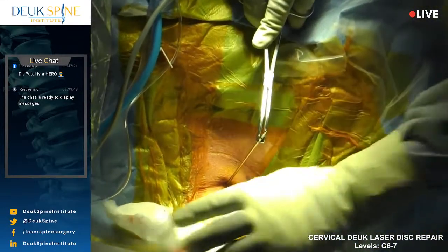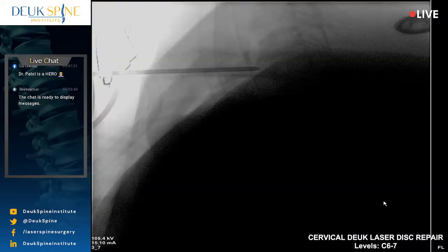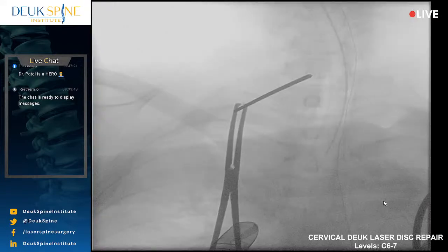We haven't really started the endoscopic part of the surgery. We're trying to get down to the spine and gain access to that disc. As long as we're in the middle, which we are, we can move forward. We're good. Nice work, mallet.